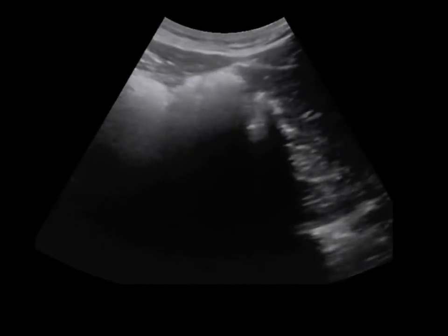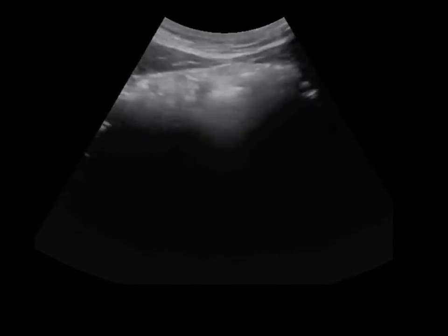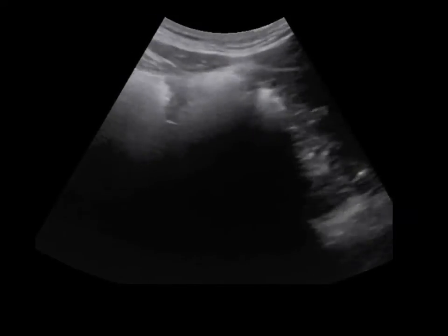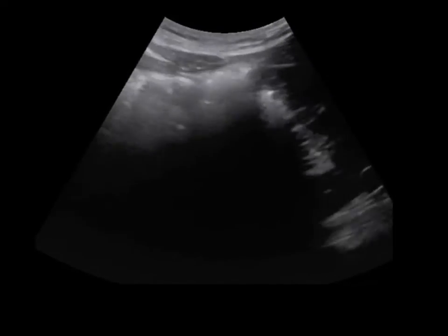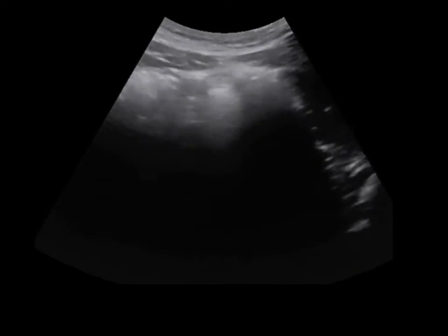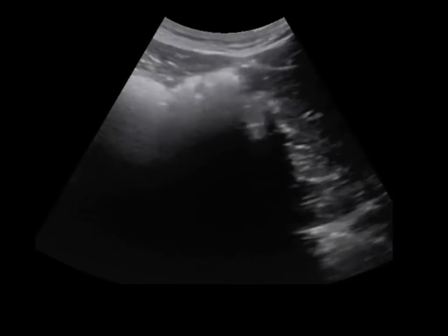So here's a nice video clip of normal bowel. Up here you can see abdominal wall musculature. And then here you're not really seeing a whole lot, and this is because the bowel is full of air. So you'll see lots of shadowing related to air, but you're not really seeing great images of the bowel itself. And this is because this is normal bowel without any evidence of a small bowel obstruction.